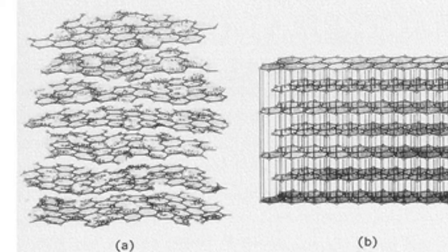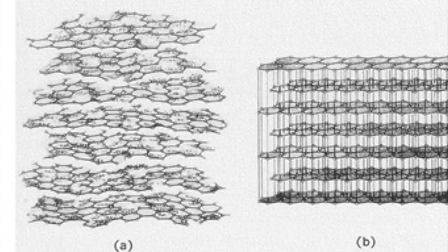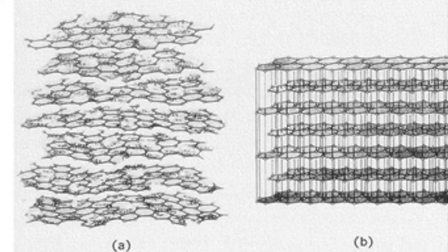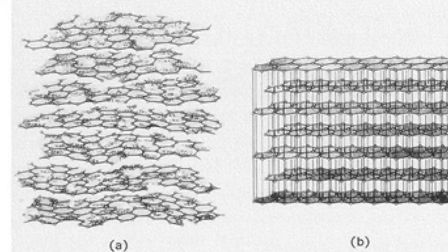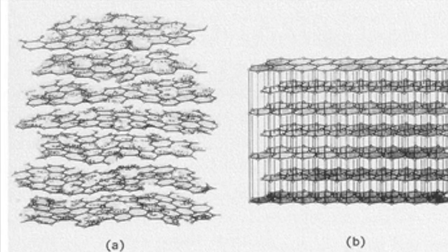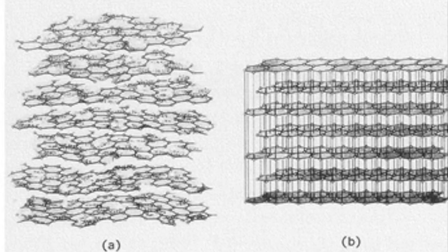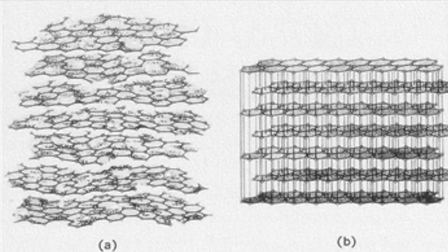Pyrolytic carbon has a structure similar to that of graphite. However, the main structural difference between the two at the molecular scale is the presence of covalent bonding interactions between the sheets of graphene in pyrolytic carbon in lieu of non-bonding van der Waals forces present in graphite. At its core, it has a polycrystalline structure arranged essentially in a mosaic. This causes pyrolytic carbon to be significantly more distorted in its shape, but also allows for greater ductility, durability, and strength in comparison to graphite.